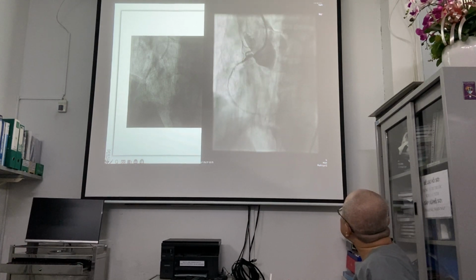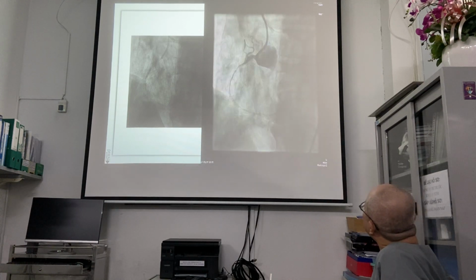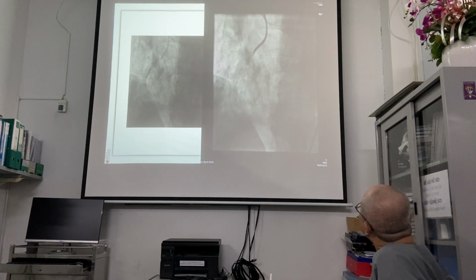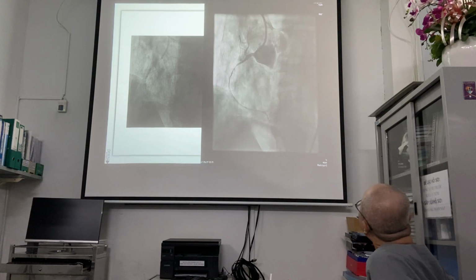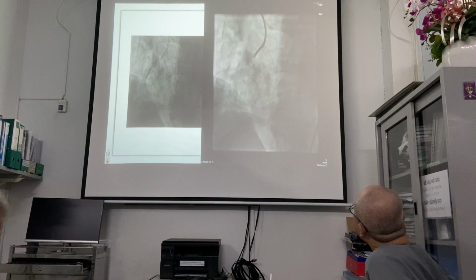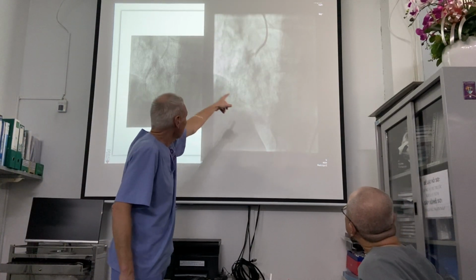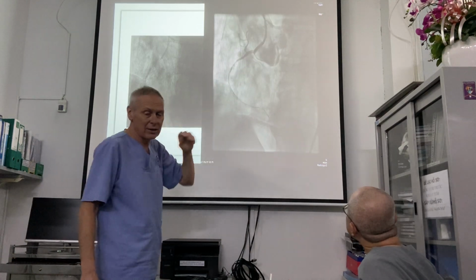And then the major problem is here. Aortic... No, not yet. No, it's not aortic dissection. So what basically happened is that after I don't know how many hours of work, we are okay, but the lesion cannot be dilated.